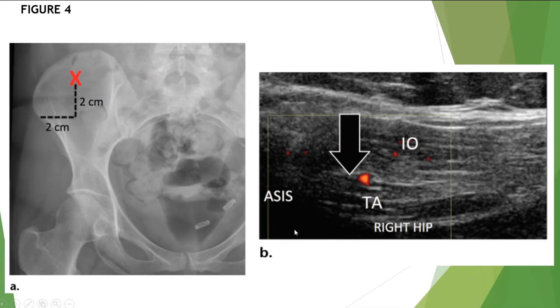And then we have the ultrasound image. It's a color Doppler ultrasound image. You have the probe oriented in an oblique transverse plane, with the medial end of the transducer directed cranially towards the umbilicus. If you can imagine that, I think you can sort of have that picture in your head. It shows us then the ilioinguinal nerve, very quickly here, next to the circumflex iliac artery, and it's between the internal oblique muscle and the transversus abdominis muscle, just cranial to the anterior superior iliac spine, which is shown here by the bone surface that has a shadow behind.